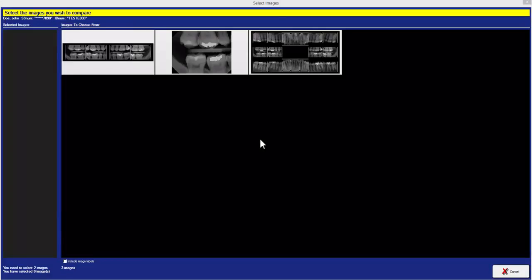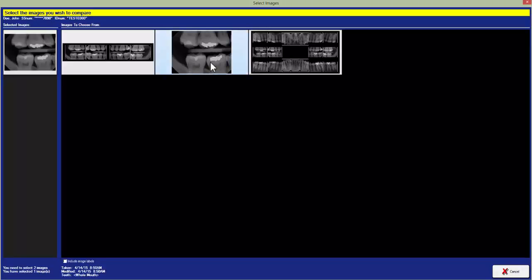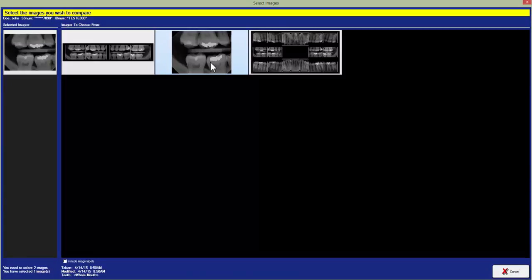Once we're on this screen now we just need to select the two x-rays we want to compare. We can select our single bite wing as well as you can select an x-ray for within a layout.